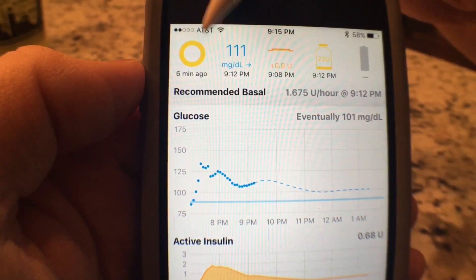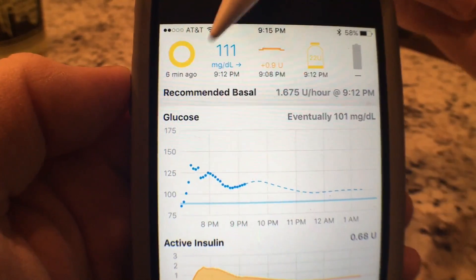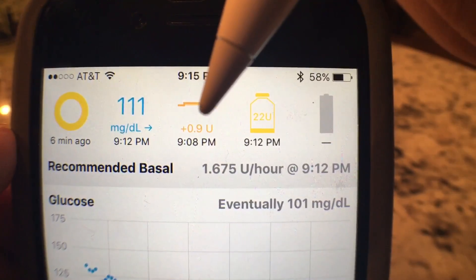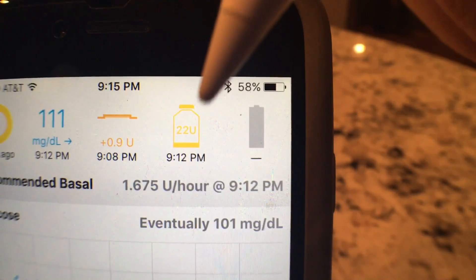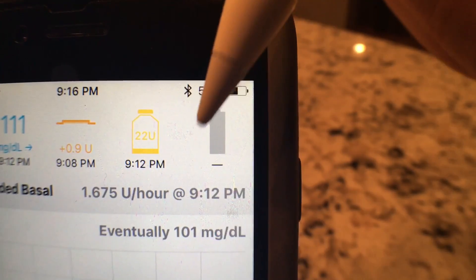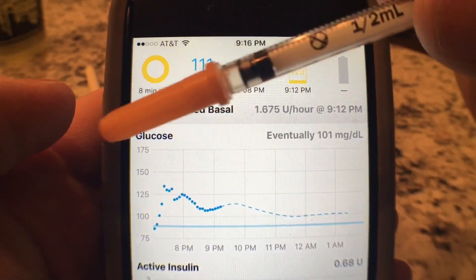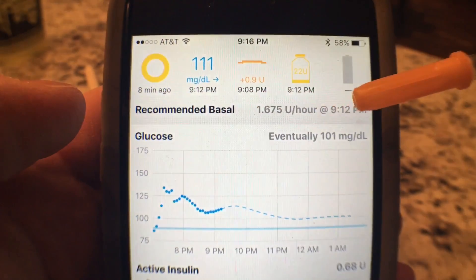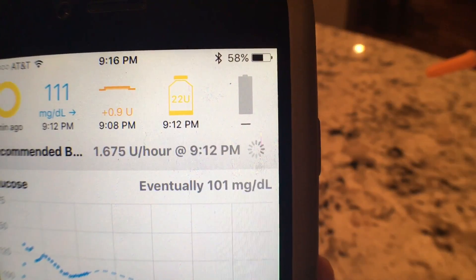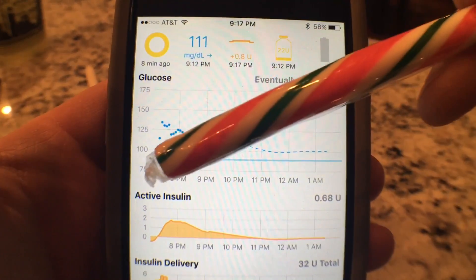Up here is the loop. You'll notice it's yellow — that means it has only completed the loop as of six minutes ago. This is my current blood glucose. This is the most recent amount of insulin the pump gave me — it was 0.9. This is how much insulin is left in my pump right now, and this one is the battery, the AAA battery in my pump. All of this up top is basically the heads up. It says recommended basal and that's how much I should get right now. If I tap it, see that little progress thing — it's waiting and it will actually then give. This whole area is my glucose, based off my Dexcom.